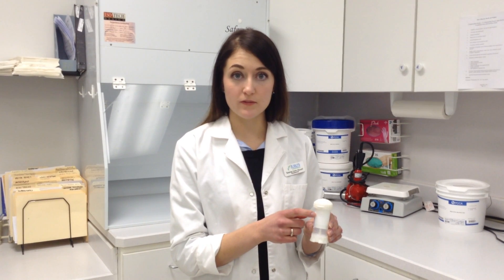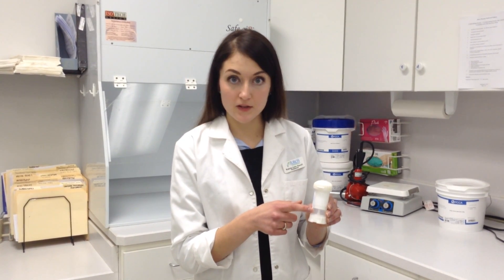You'll also notice on the back of the ToppyClick is the embossed word, refill. When the bottom of the plunger reaches this refill line, it's a good indicator that it's time to call the pharmacy for a refill on your cream.